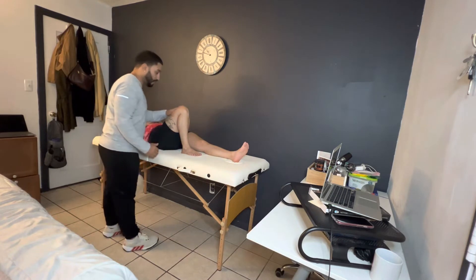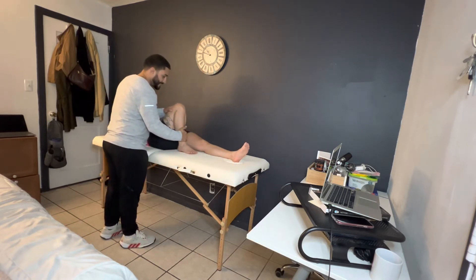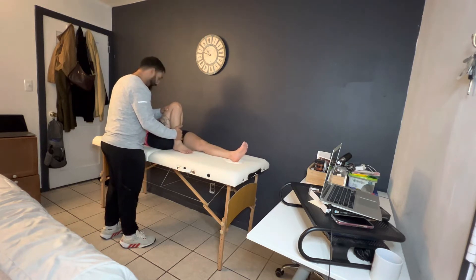I'm going to go ahead and see how much further we can go. I'm going to put my hand right here on your thigh just to secure your leg, and I'm going to bend this knee just a little bit more. See how that end feel of that joint is? It's a nice, soft, bouncy feel here. Any pain at all? Any discomfort? Perfect.